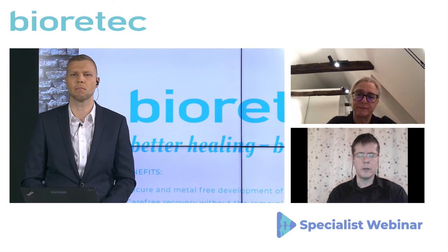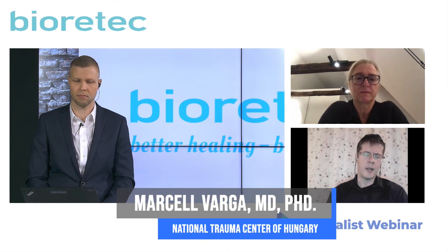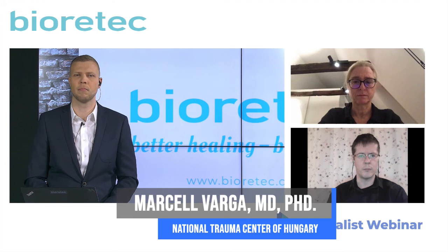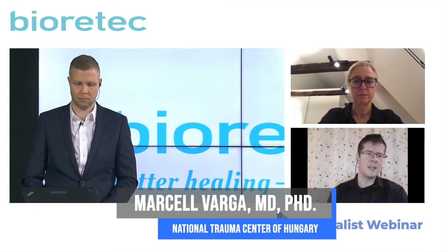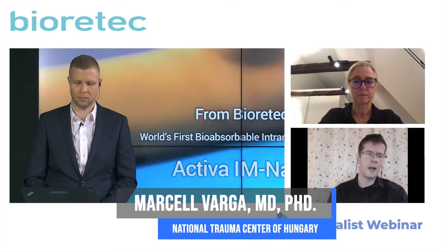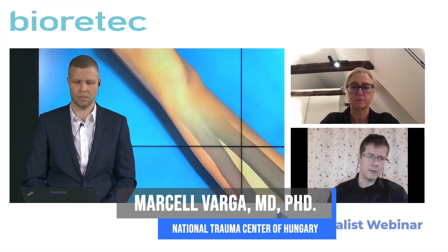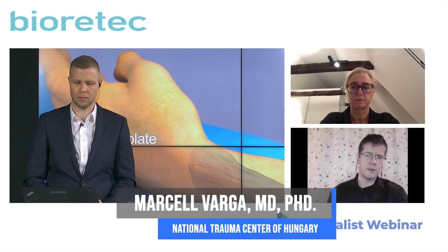Yes, I think every fluoroscopy machine is different. I haven't said that the TCP cannot be seen, but perhaps some fluoroscopy machines show other pictures. So before the operation, if you use a different fluoroscopy machine, you should check if you can see the end well. Sometimes there is a need for small adjustment, because it can be very frustrating when you are inside the bone and you look for the sign of the TCP and where it is, and if it doesn't seem so well, it can be a bad situation. But it can always be seen, perhaps with small adjustment the visualization becomes better.